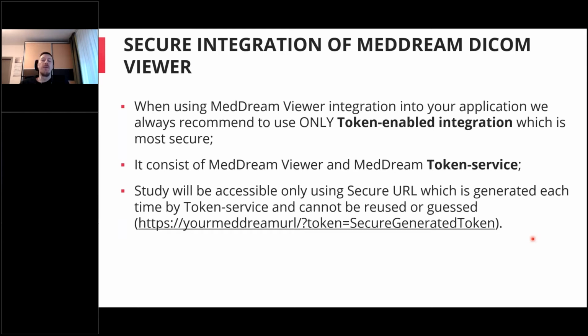So what does this token-enabled integration do? You would have the secure URL integration where your link to the specific study would be your MedDream URL, question mark, token, and this securely generated token. This token cannot be reused. It cannot be guessed because it's more than 100 characters long, and it has the expiry time and all these other settings.